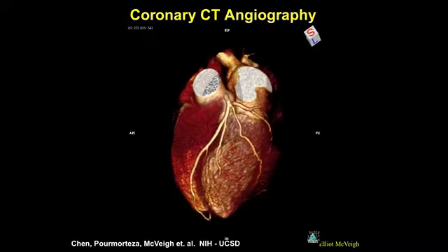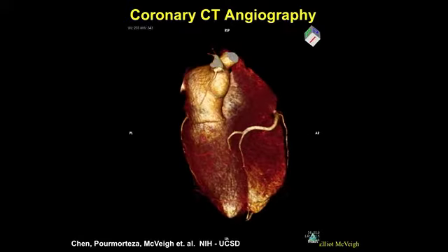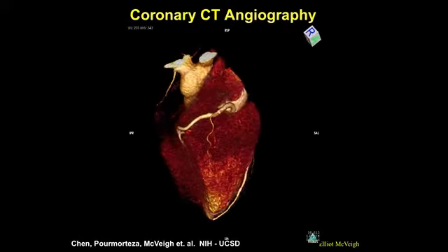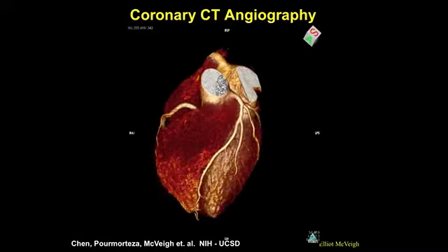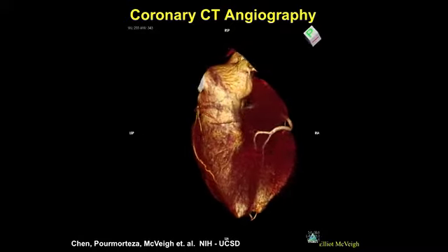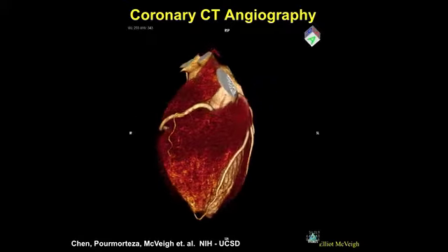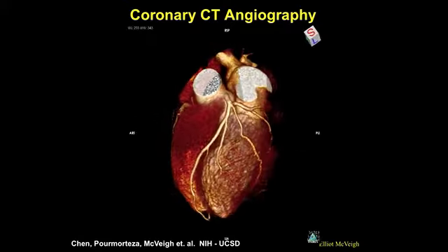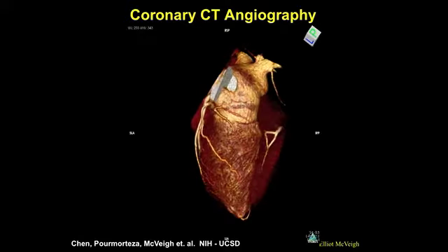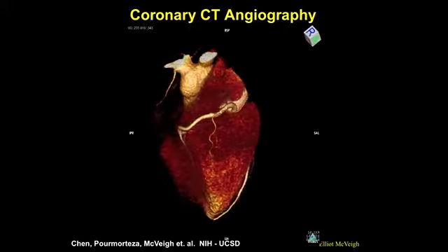And in CT, we'll look at K-space on occasion, but for the most part, we can think about it just in space, okay? And the detector array that obtains this data is just like a camera, right? It's just an 800 by 256 camera. And boom, it takes pictures and takes them at different angles. We'll take a look at that in a second.